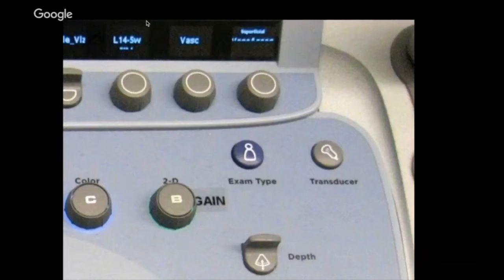So you'll see in the top right here, we have the ability to choose between transducers and exam types. Awesome. Like, yes, I want to go and use a linear probe. I need to know where to do that. We have this button called B in 2D, which is frustrating. And we've gone on our machines and labeled gain. That's what that button is.